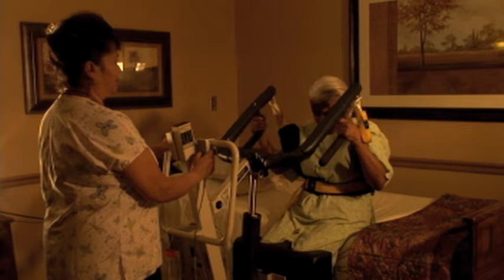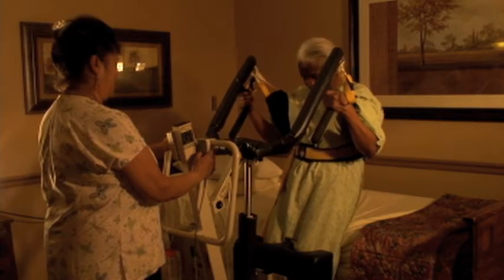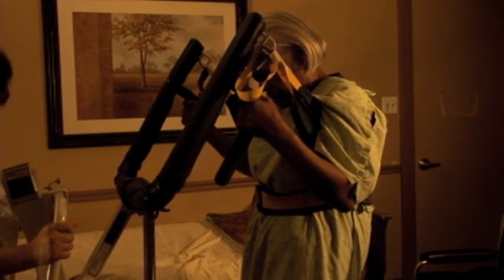Next, crank the resident up into a standing position. Unlock the lift brakes and pull the lift away from the chair or bed. After you are clear, put the legs of the lift back to the proper setting.